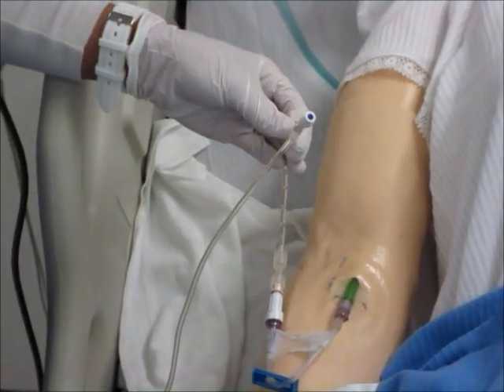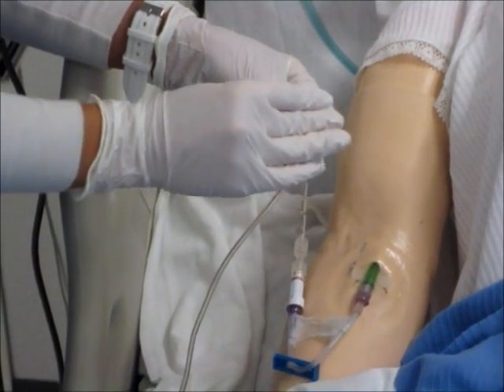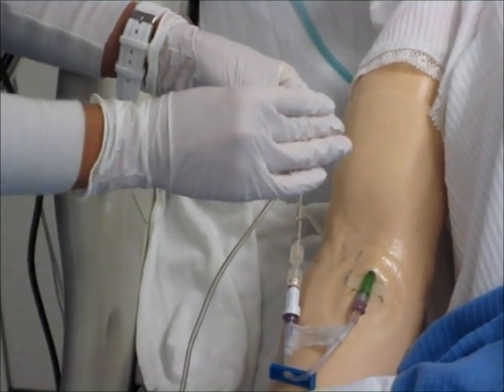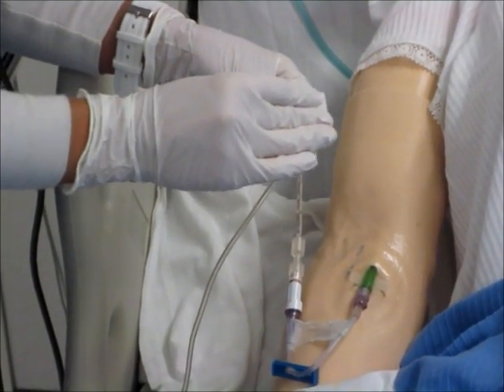She will then clean the injection port closest to the patient with an alcohol swab. If the IV is a peripheral IV, she will clean it once for 15 seconds. If it is a central line, she will clean it 3 times for 30 seconds each time.